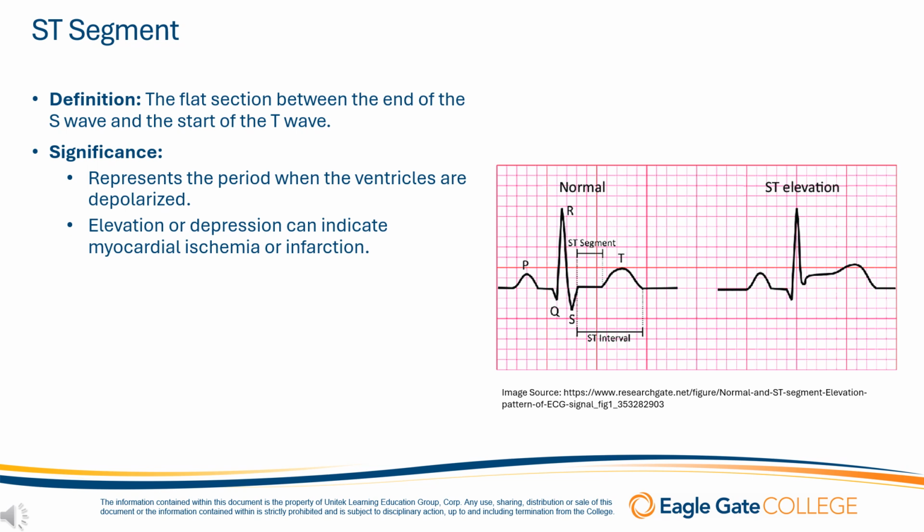The most common cause of ST elevation is a myocardial infarction. During an acute myocardial infarction, the affected area of the heart muscle becomes injured due to a lack of oxygen, causing the ST segment to rise.